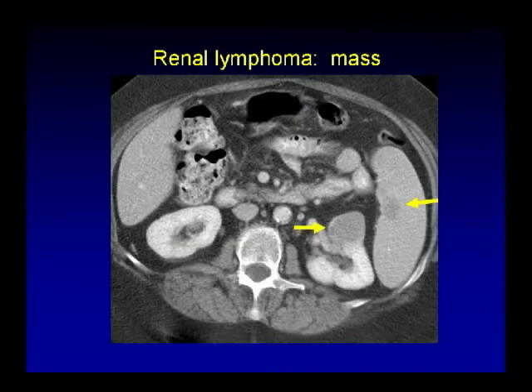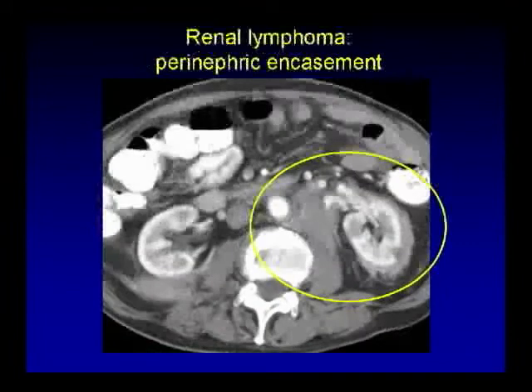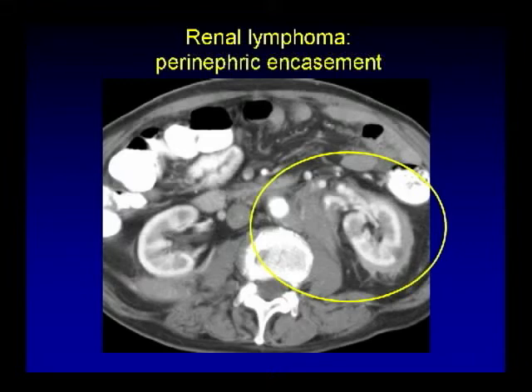Here's a solid left renal mass — also notice the mass in the spleen — renal lymphoma in this case. The next case shows infiltrated bilateral renal masses with retroperitoneal adenopathy, another presentation of renal lymphoma. Here you see conglomerate retroperitoneal adenopathy that extends to encase the left kidney — this is another presentation of renal lymphoma with perinephric encasement.